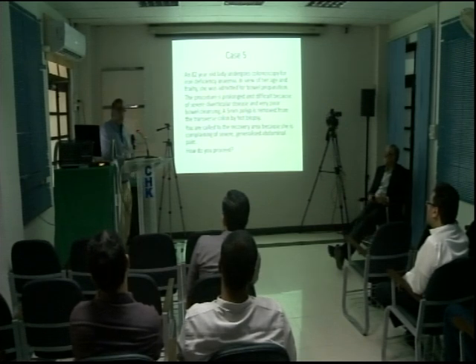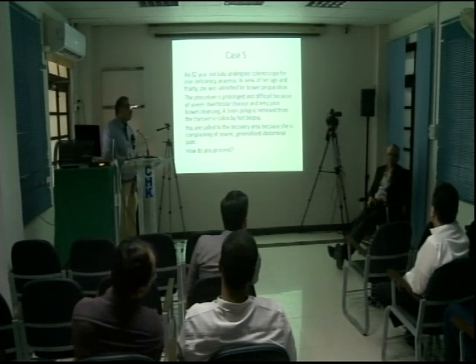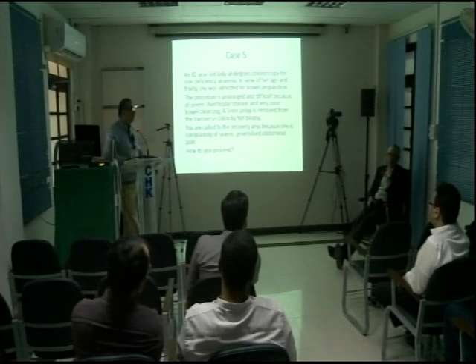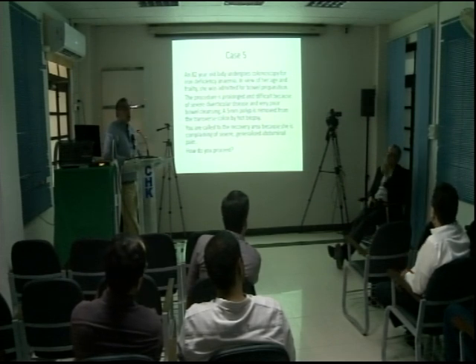Secondly, hot biopsy forceps are banned in most of England, and in our hospital. Nobody uses it. I think the only place where you can make a case for hot biopsy forceps, in my opinion, is rectal, and even there be careful. Exactly, if it is a 5 mm polyp and you want to remove it, take it out with biopsy forceps.